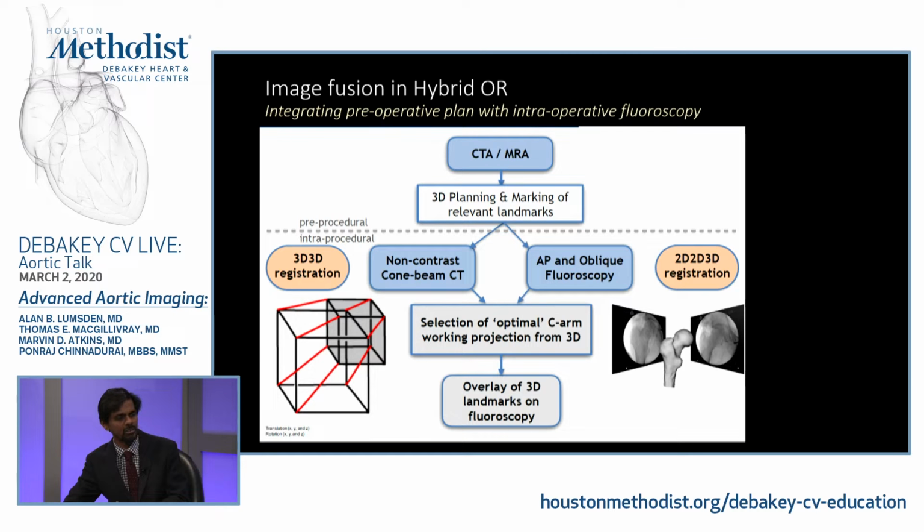Image registration is a technical term, and a more colloquial term is image fusion, which is putting together any two data sets. Image registration can be broadly classified, and this is a very broad classification, into two routes. One is creating another 3D scan in the operating room, like in the video I showed earlier. That is done without any contrast, and now you can put two cubes together.